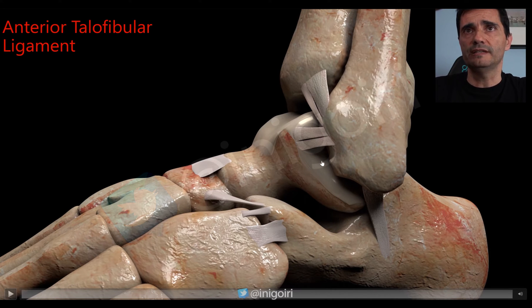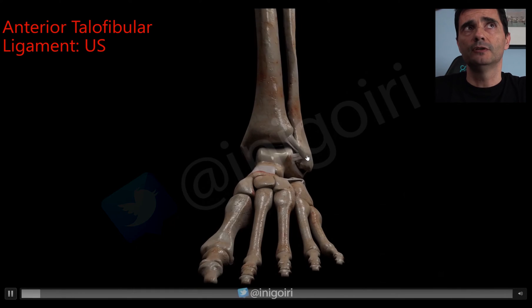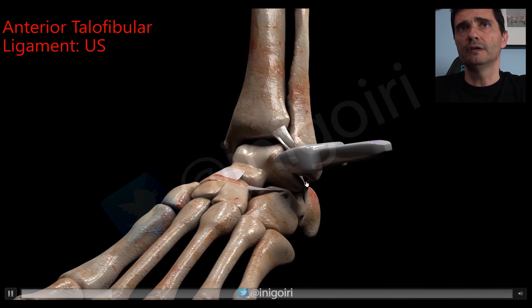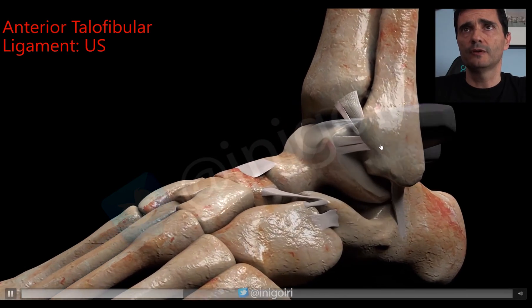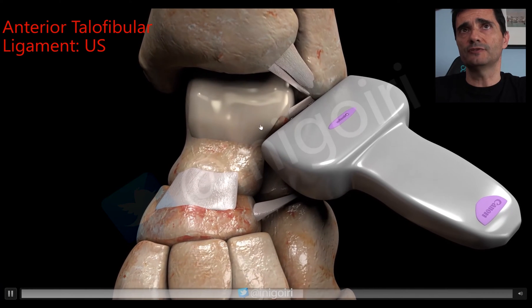Sometimes the inferior band has a bridge with the calcaneofibular ligament. When searching this ligament and you have a nice view, don't forget to go upwards and downwards — otherwise you will sometimes miss pathology. To examine it, place the probe over the fibula and then lie it over the talus in this orientation, parallel to the sole of the foot.